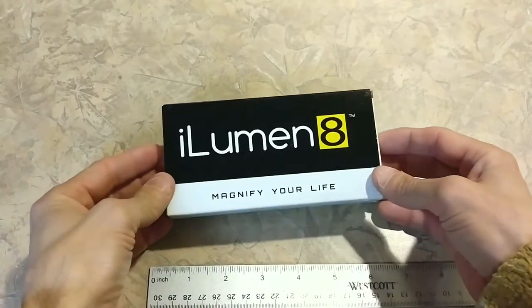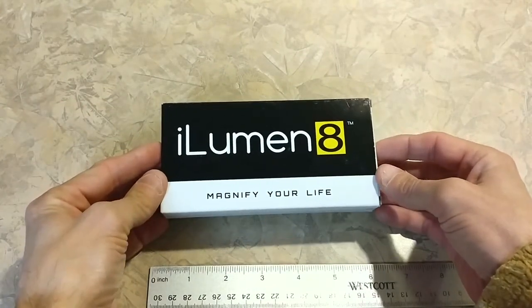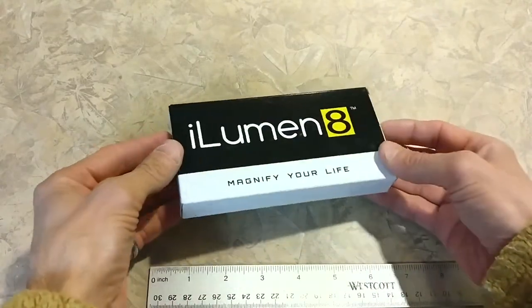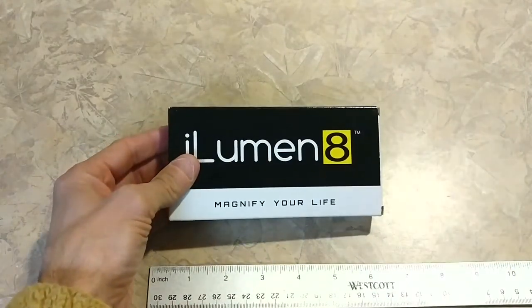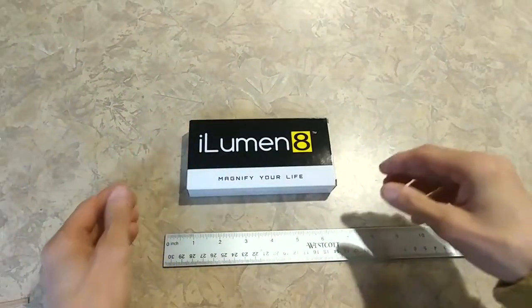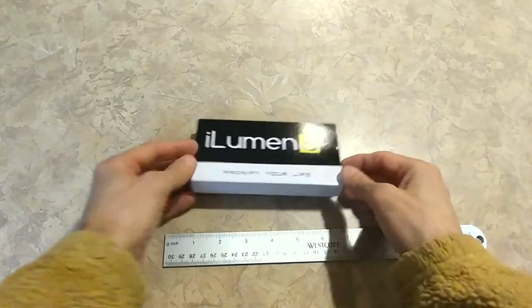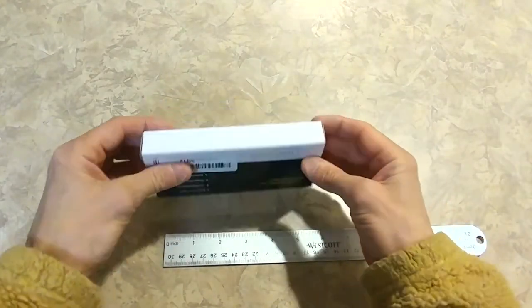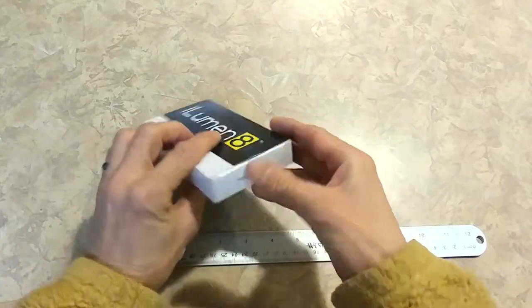Today we're going to take a look at a pocket magnifier by Illuminate. It's a very nice looking gift box here — pretty elegant, actually.